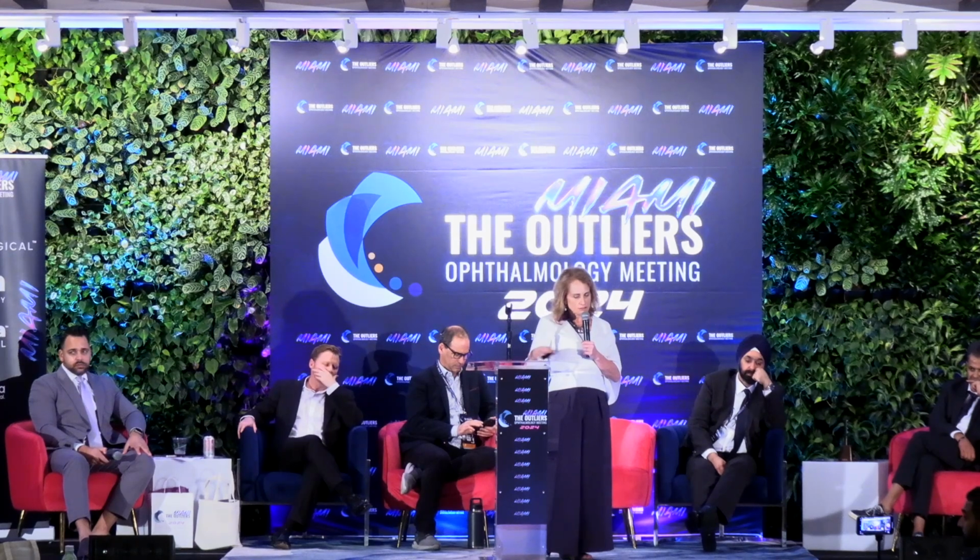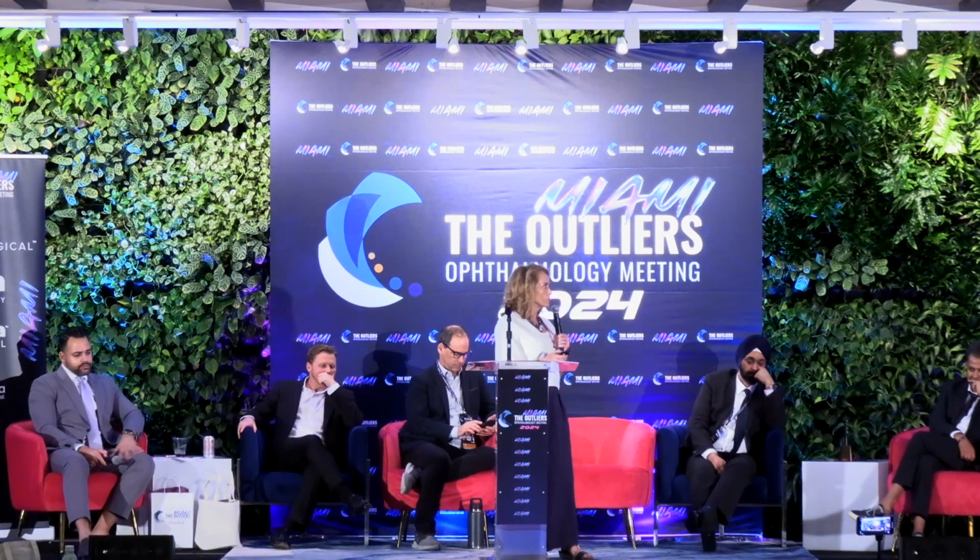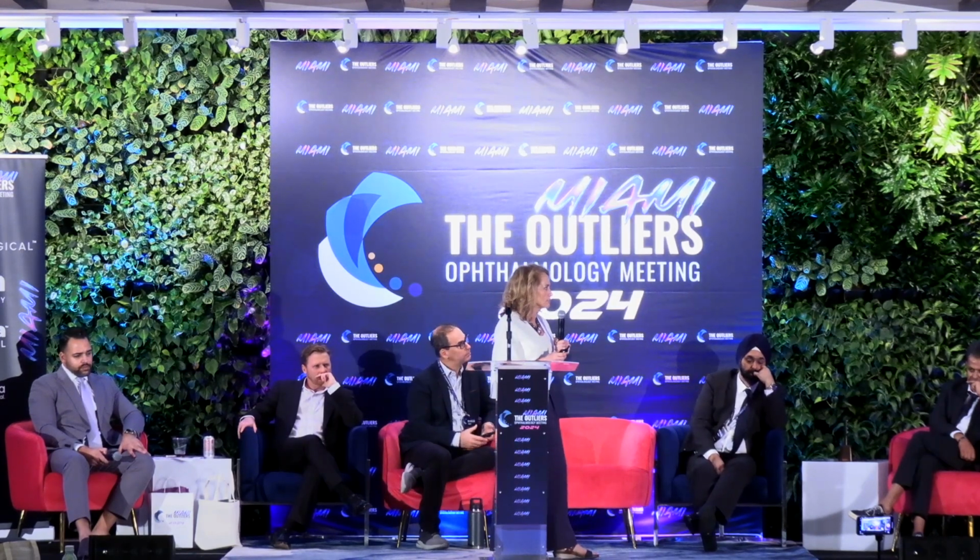So you can see here that those patients who are hyperosmolar, those are the ones that have greater than a diopter of variability in their pre-op keratometry. And so we're going to see that we have more refractive misses in the patients who have untreated hyperosmolarity. And in our practice, we do take it really seriously.